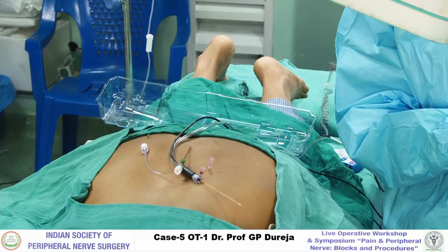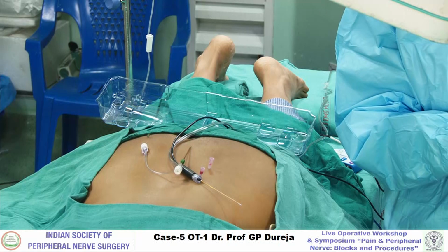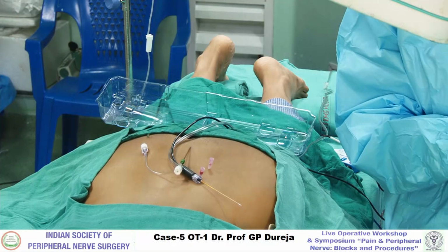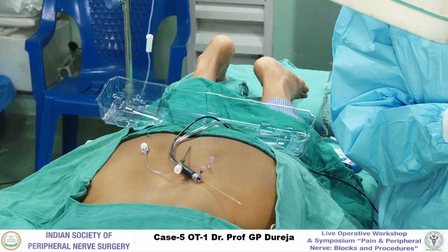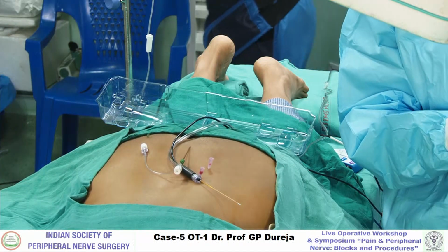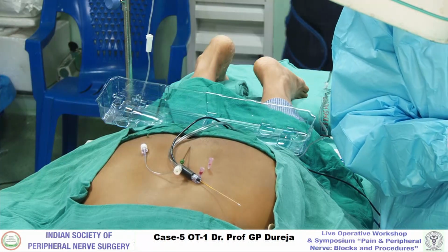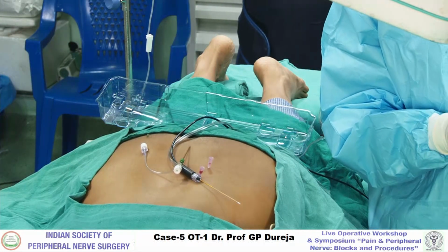So we are targeting the facet joints by doing the radiofrequency ablation of the L4-5 and L3, L4 medial branches, and we will be targeting the radicular component by doing an L4-5 root block. So we are doing a cooled RF of the L4-5 and L3, L4 medial branches. Over to Dr. Dhruv, please.